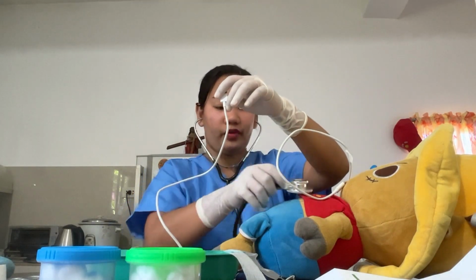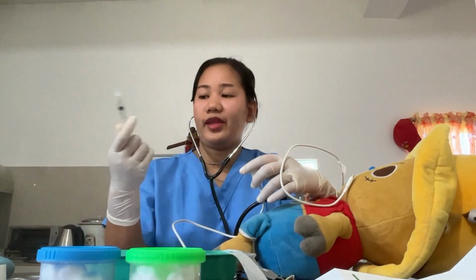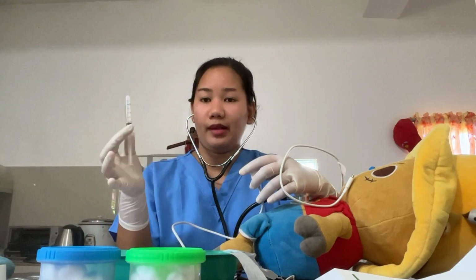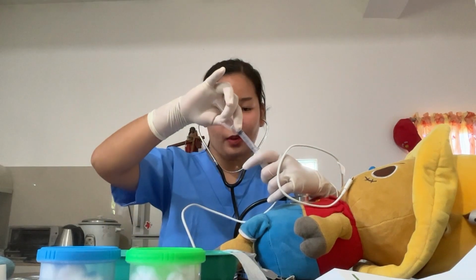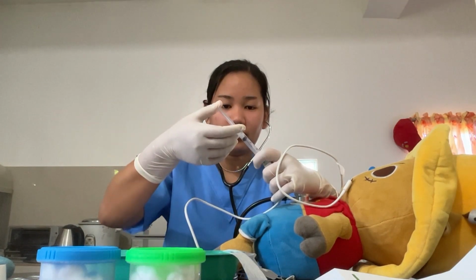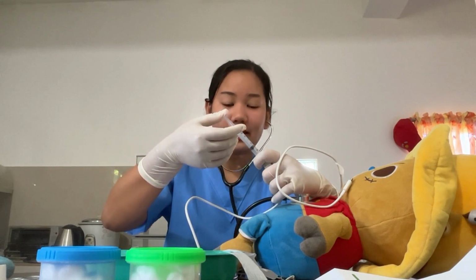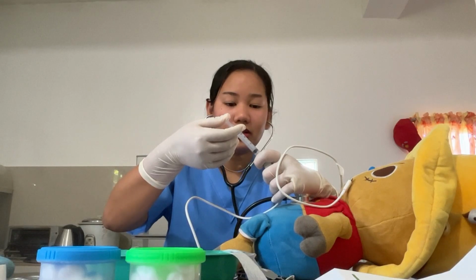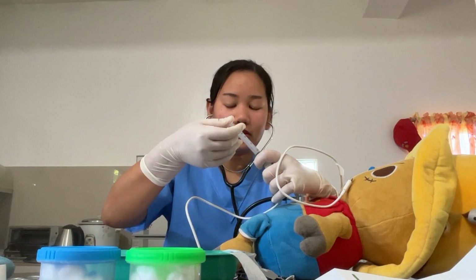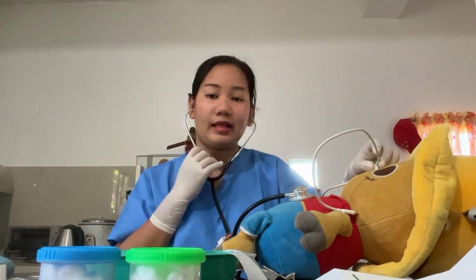I will place this over her epigastrium, and then let's assume that this is 20 to 30 ml of air. So I will now inject, while listening for a whooshing sound. Okay, so everything is clear.